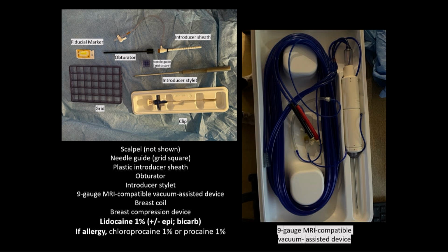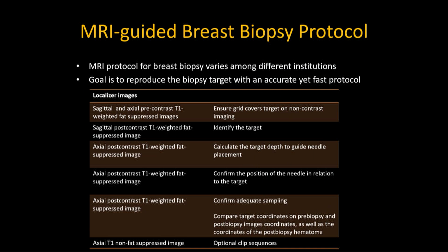We use lidocaine 1% without epinephrine. I know many places use with epinephrine and bicarbonate. We had an epinephrine shortage during COVID, transitioned to lidocaine 1%, and have not had any issues after that. If there is an allergy, we use the others in the caine family, including procaine. So similarly, it's important to be familiar with your MRI-guided breast biopsy protocol.